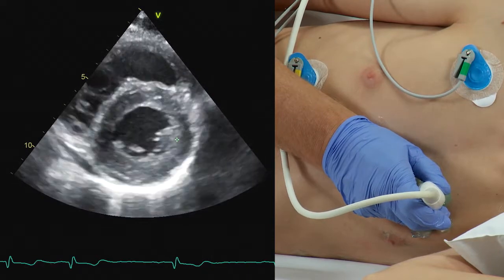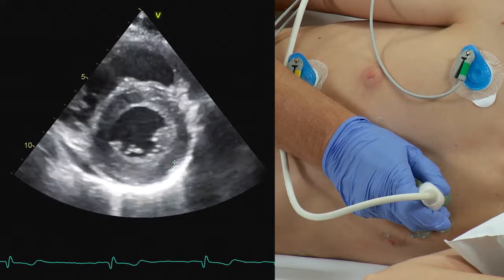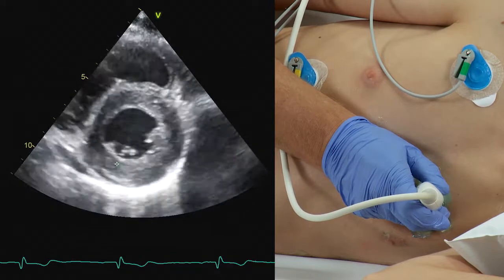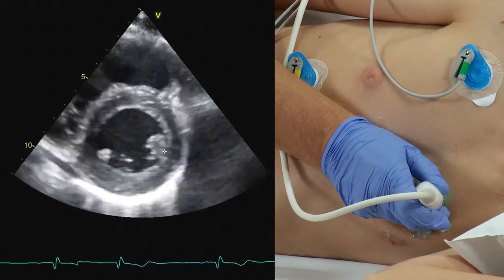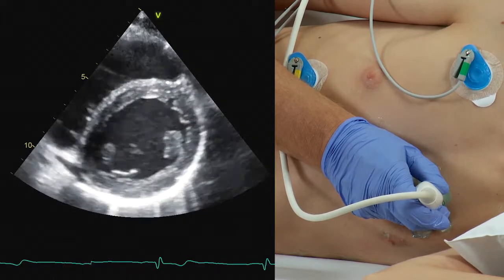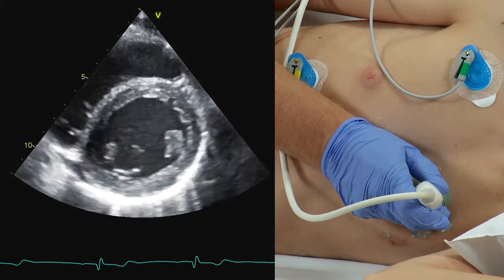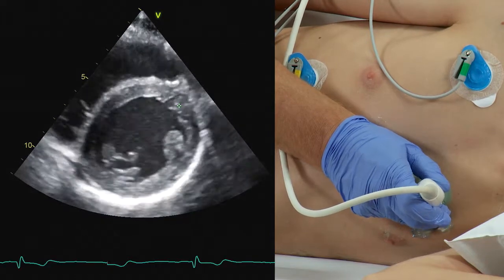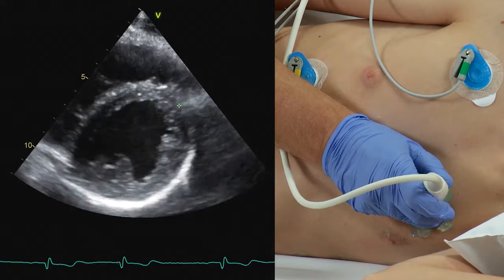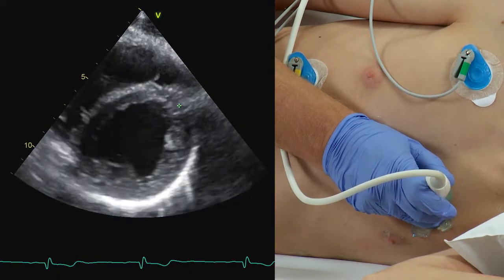The further down you go, the more you will see the attachment of the papillary muscle with the wall. One muscle is here, here's the other one. You can nicely appreciate here the pericardium, which is the very echodense structure. Then you tilt downwards and look what happens to the size of the left ventricle. You see it gets smaller and smaller.